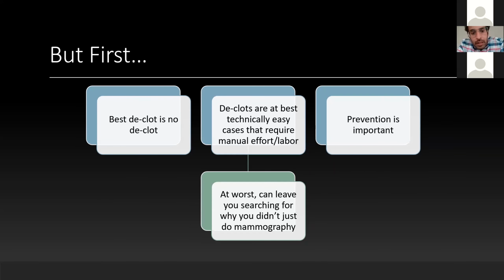But first, the best declot is no declot. Again, we really want to strive to prevent our patients from coming to us with clotted access. Declots at best are technically easy, but they just require a lot of time and effort. And unfortunately, at worst, you're left searching for why you didn't just do mammography or something like that. They can be a pain and really difficult. And again, like we talked about, prevention is really important.